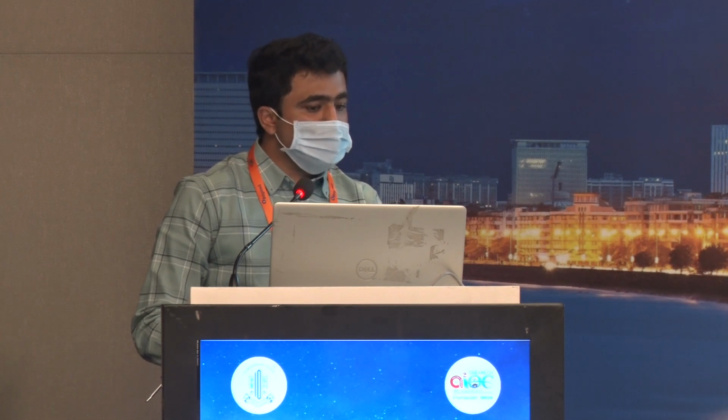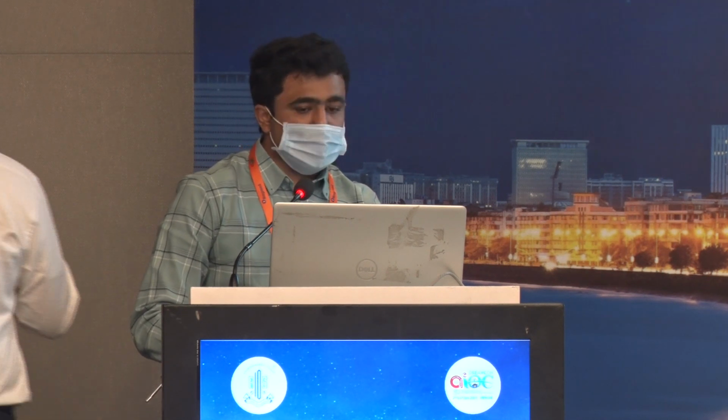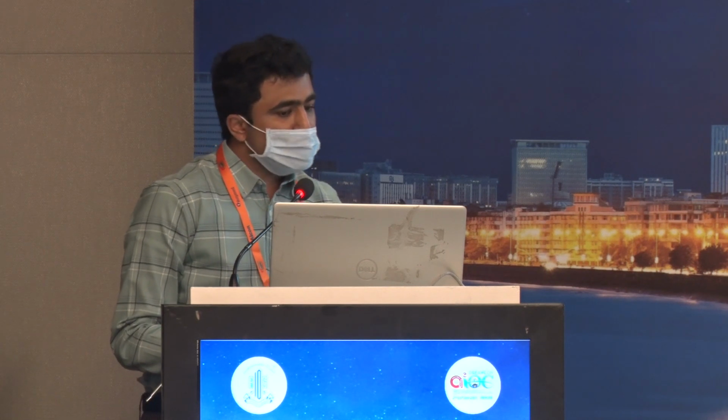Whereas scleral fixated IOL has the advantage of more physiological position near the nodal point of the eye and greater distance from the cornea. Now SF-IOLs are broadly classified as either sutured or sutureless. When we come to the sutured SF-IOL, which was practiced more before, suture erosion and breakage was very high. Because of that, lens dislocation, lens tilt and other complications were also seen. Then the concept of glued IOLs was introduced by Dr. Amar Agarwal, in which the biological glue, that is a quick-acting surgical fibrin sealant from human blood plasma, is used. With the glued IOLs, the complications were scleral flap issues, haptic extrusion, and haptic breakage.